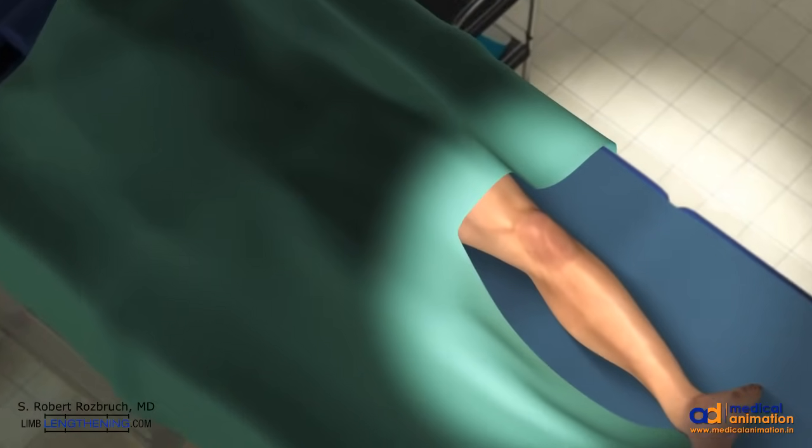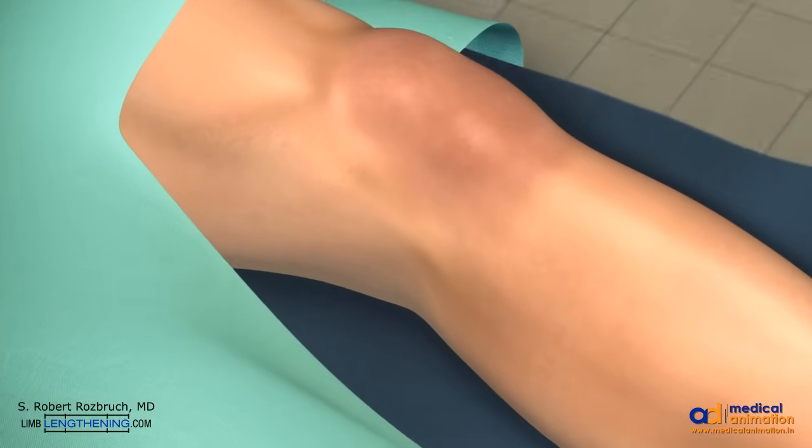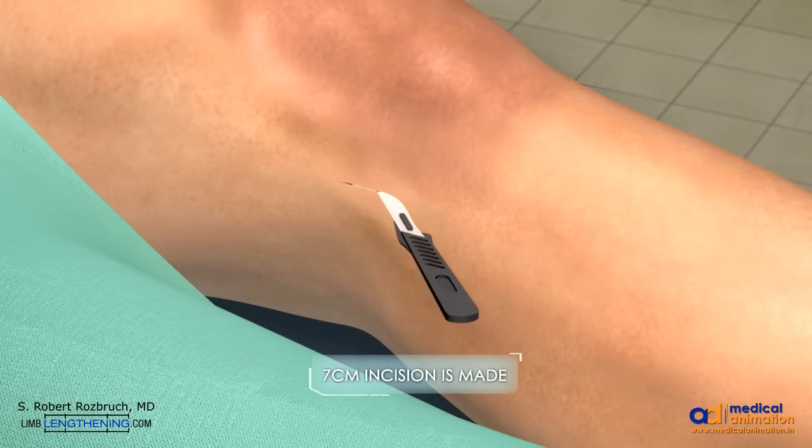You can see the patient is positioned supine. The medial side is approached through a seven centimeter incision just at the proximal part of the tibia.